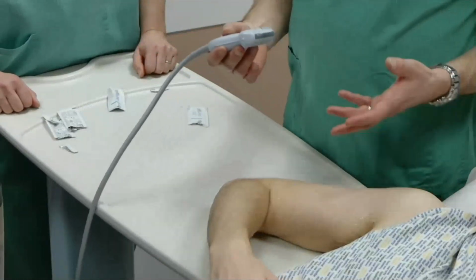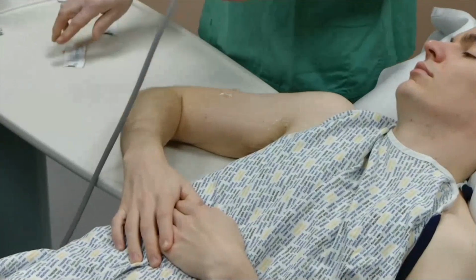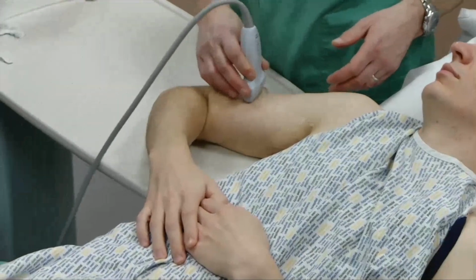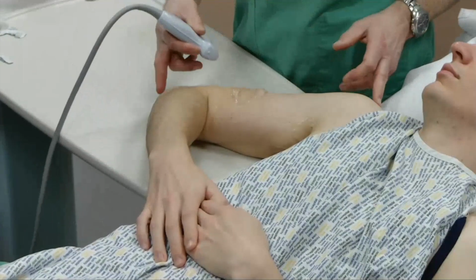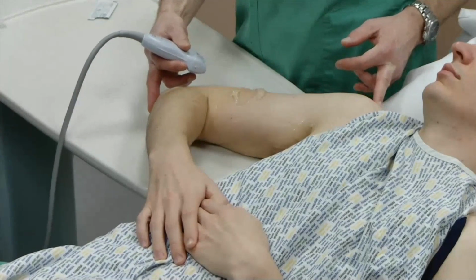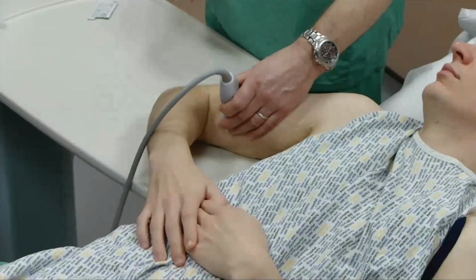Now the radial nerve we saw, we said it sat on the conjoint tendon, and as it goes beyond the conjoint tendon, it drops down and goes round the back of the spiral groove of the humerus to re-emerge on the anterolateral side of the distal arm. So as a kind of overview of where to put your needle, again, if you just take the whole of the proximal arm, split it into thirds, I'm going to go sort of between 2/3 and 1/3 on the distal part of the arm, slightly anterolateral.